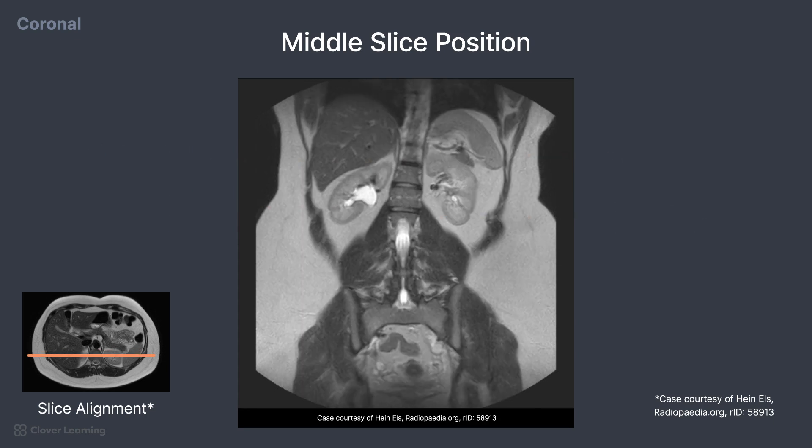Continuing posteriorly, a more complete view of the spleen is now visible. The bright area at midline of the spine is CSF contained within the spinal canal.